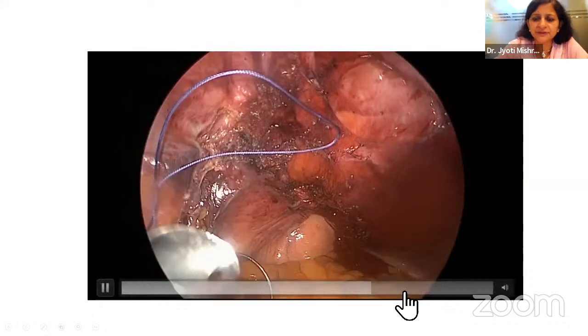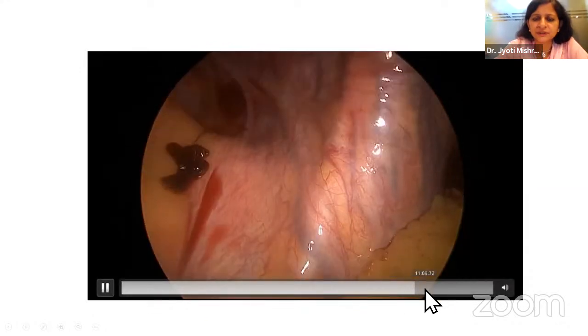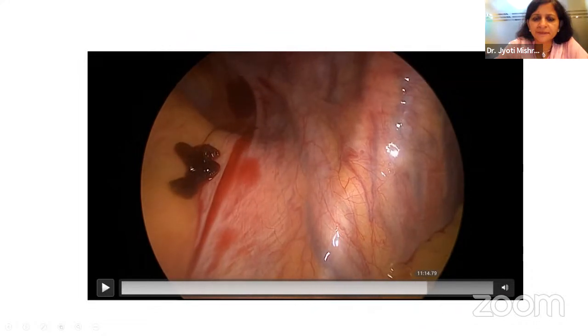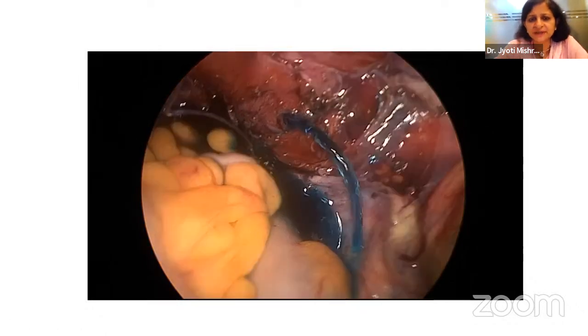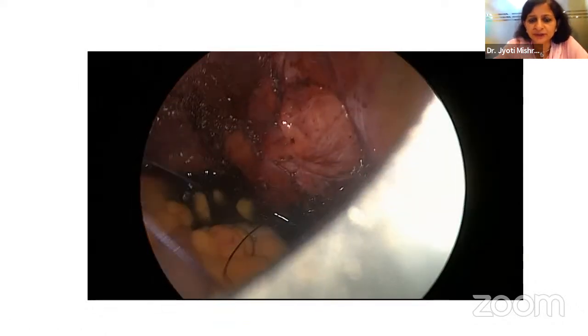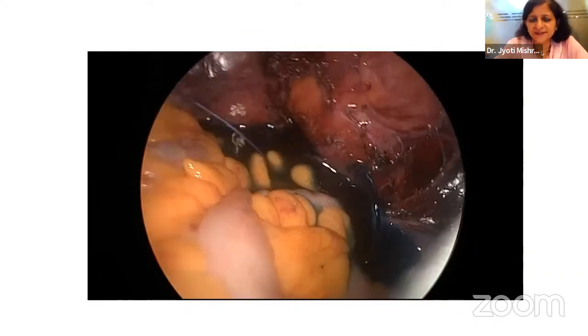But as we filled it further, we traced the ureters, the peristalsis, and then we found this. We could have just stopped and said everything is fine. But the small injury, maybe it was just waiting for more stretch to happen. So now what? What next?